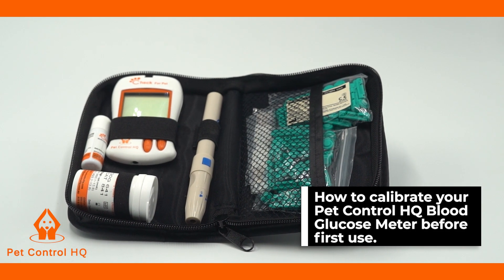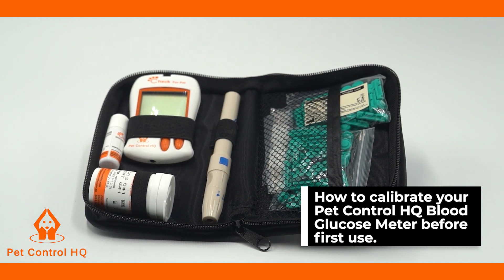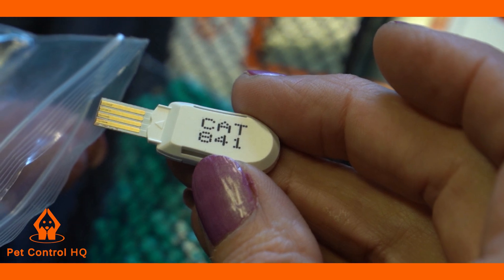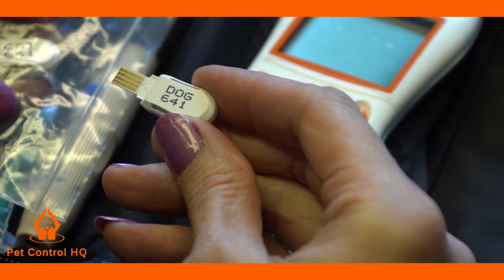This is a brief overview on how to calibrate your PetControl HQ blood glucose meter before first use. The code chips that come in your kit are used to calibrate the test strip with the meter for accurate results.